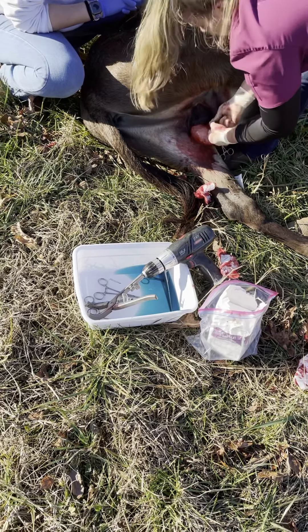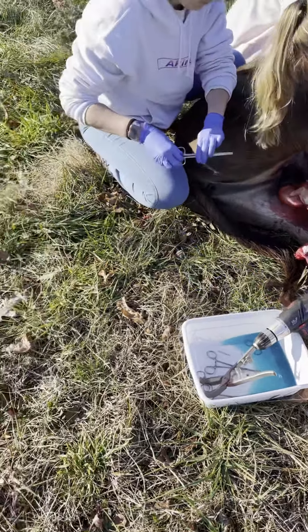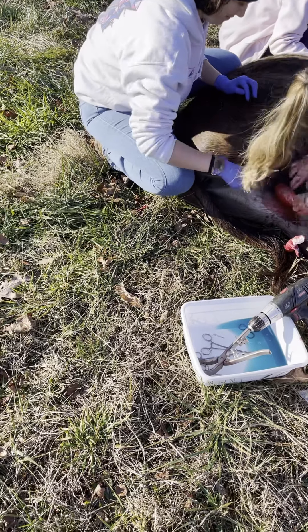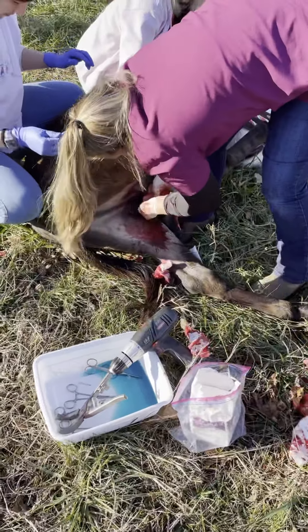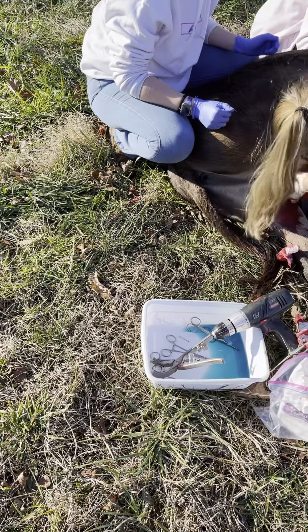Get those scissors — your hands are clean, right? Hopefully that doesn't bleed a ton. We got what we need. Just a little bit more to dissect down here. Push it off the cord.